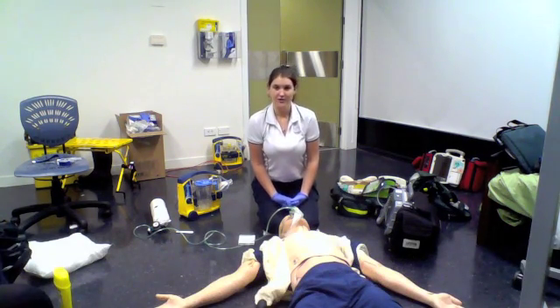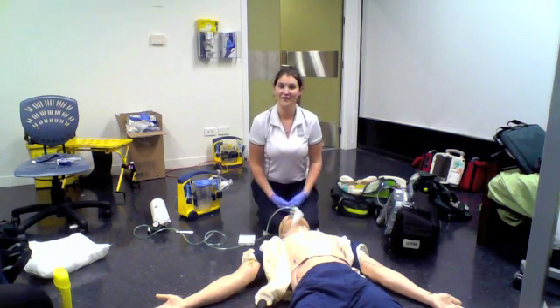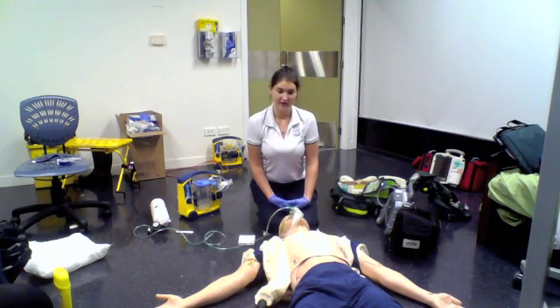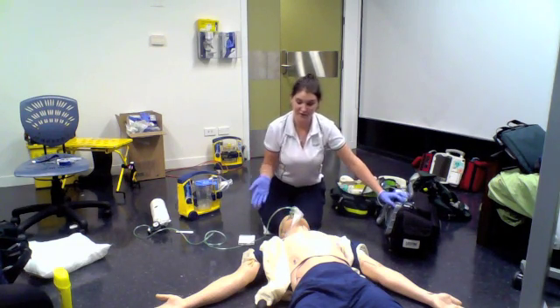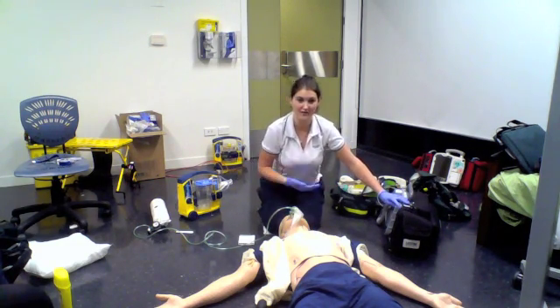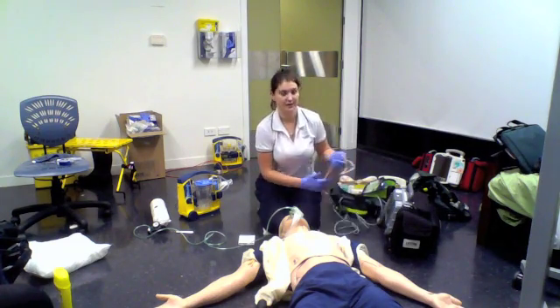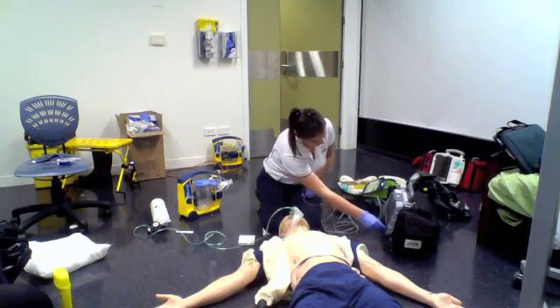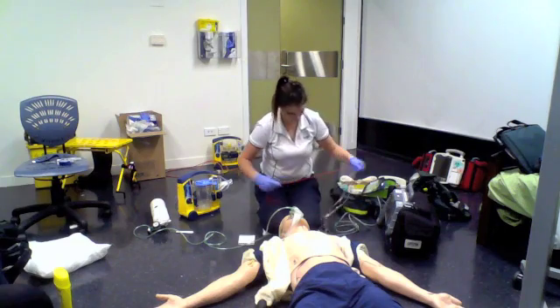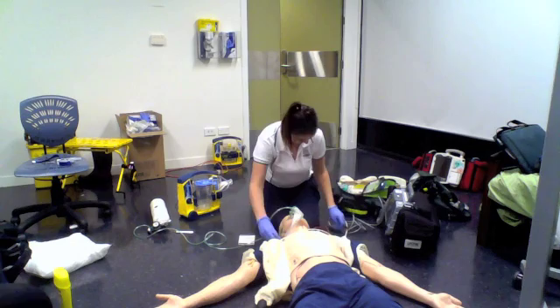So in preparation, my RSI ICP wants me to prepare for intubation, rapid sequence intubation, and he'll be 10 minutes away. So I'm just going to prep the patient. I'd get a full set of vitals anyway, which my offsider or I would be doing. Put the monitor in manual mode and start attaching my ECG stuff.